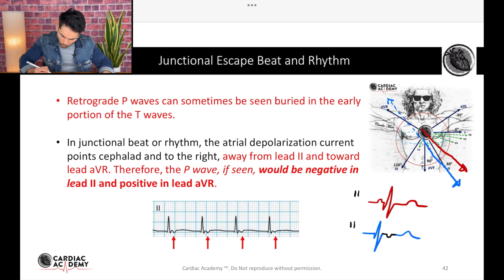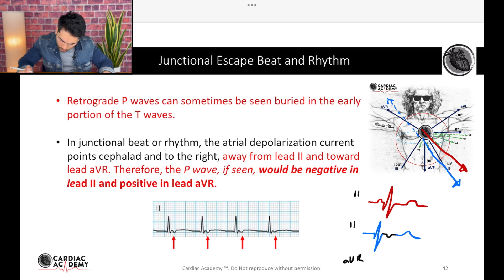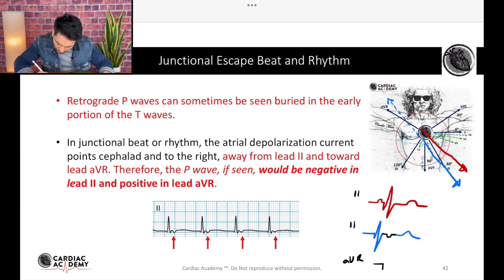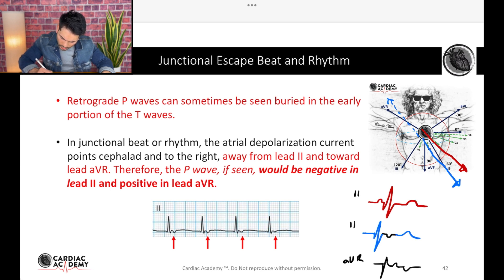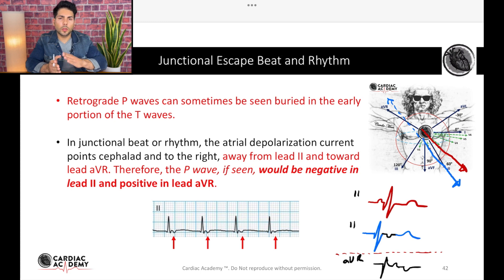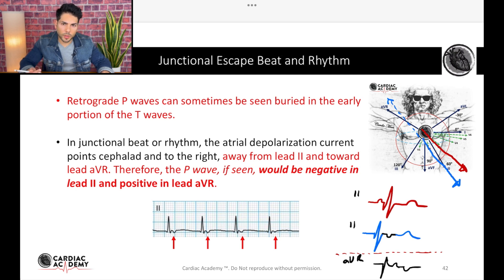If we look at the opposing lead, AVR, it would look like a mirror image. In AVR, you're going to see a P wave, but instead of seeing an R wave you'll see a dominant S wave, a small R wave, an upright P wave, and then an inverted T wave. It should look like a mirror image because it's the lead looking from the other side — that depolarization is going towards it, so it records a positive P wave.